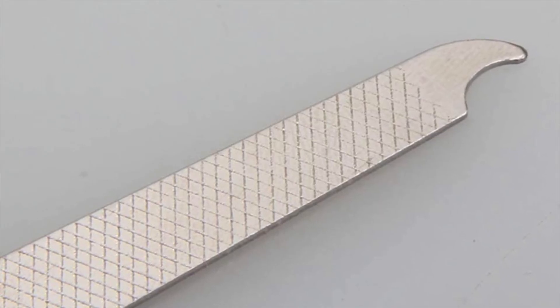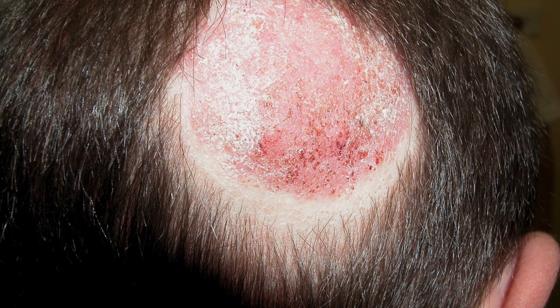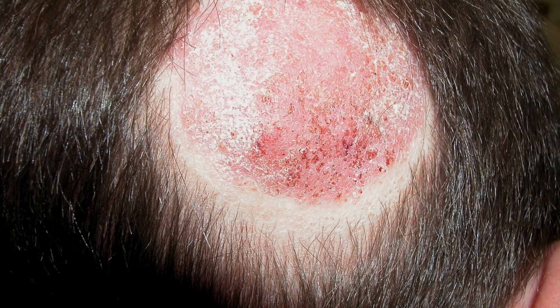Mycology specimens of the scalp and hair can be taken in a number of ways. If the scalp is scaly, exactly the same process as is used for skin elsewhere can be used, using a scalpel to produce the scale.